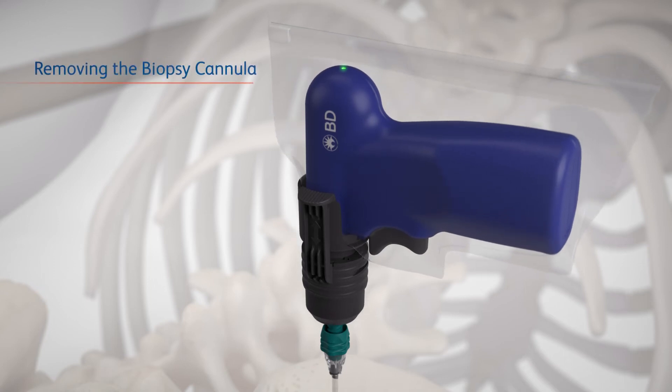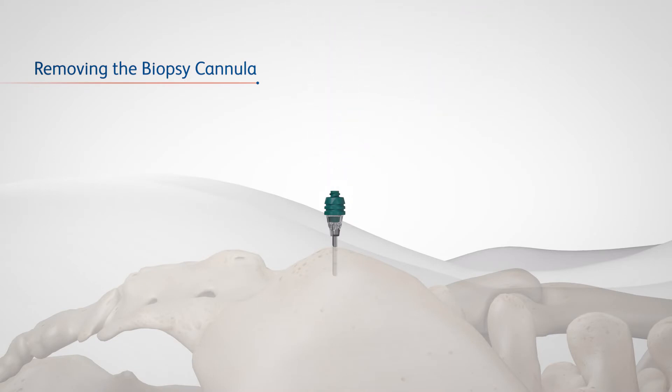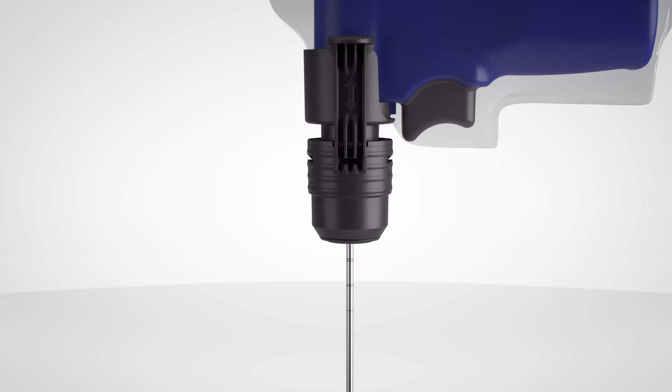To remove, with the trigger still engaged, pull up on the power driver until the biopsy cannula is completely free of the patient. Then detach the biopsy cannula from the power driver.